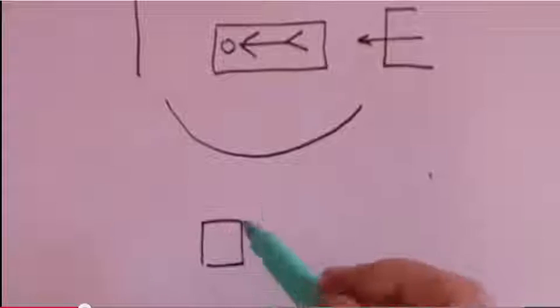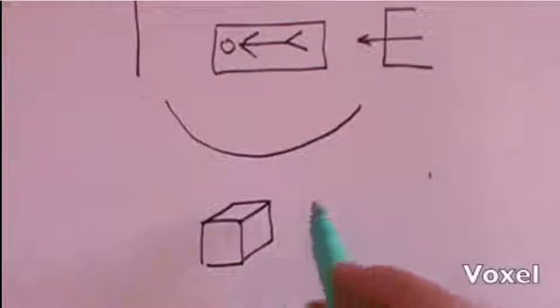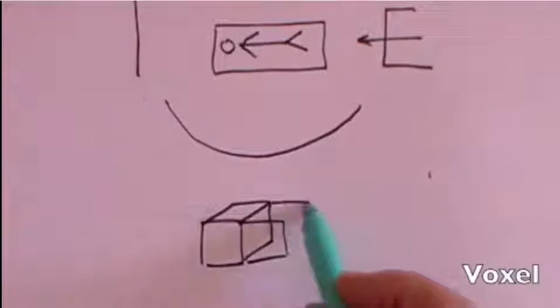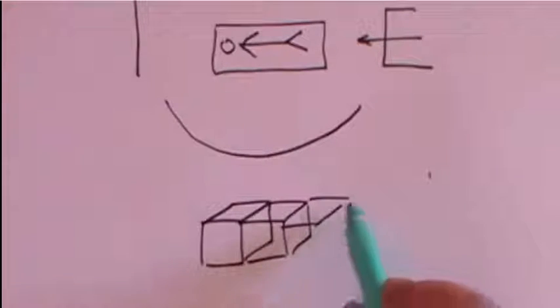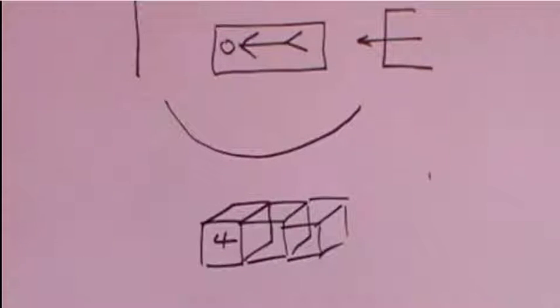There are little boxes called voxels that contain the 3D information, because they also contain the volume, and they contain the coefficient of attenuation of every tissue the beam passes through. Every voxel has a different constant of attenuation. This constant is how the tissue absorbs the radiation.